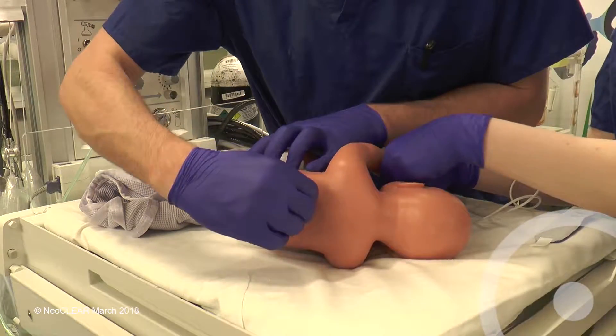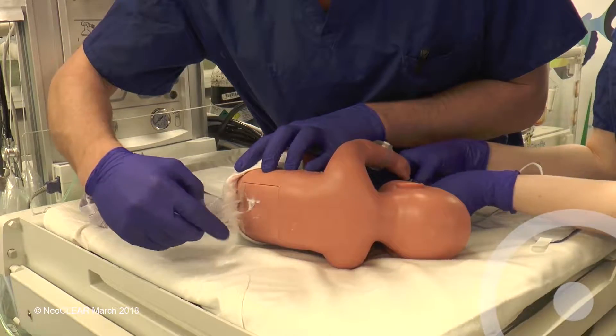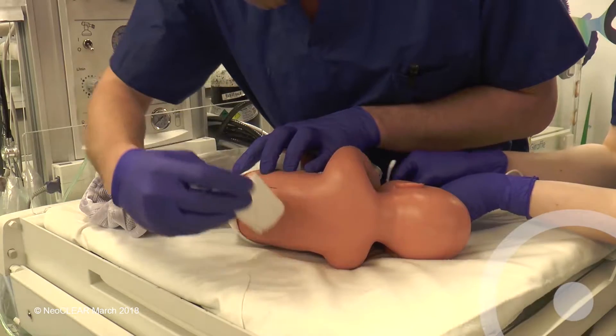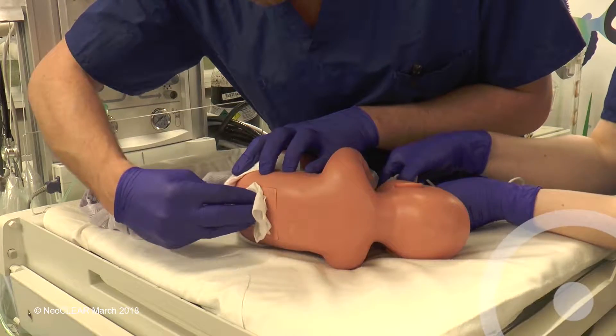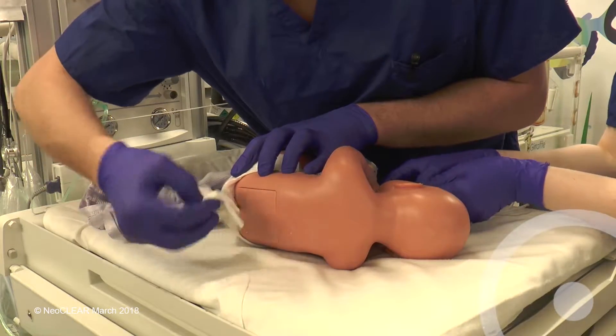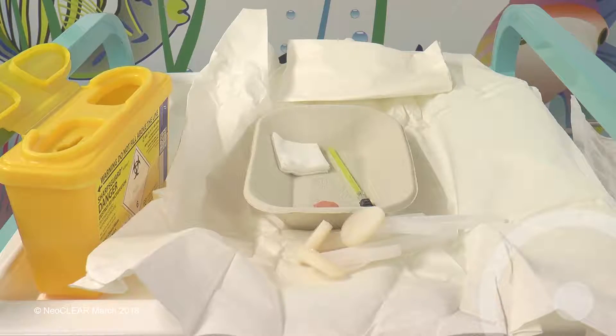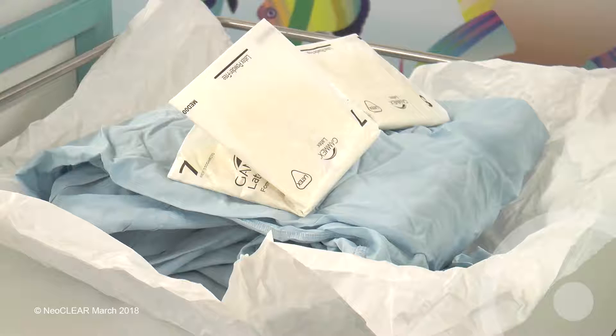Attach the SATS monitor to the right hand and ensure that the trace is adequate. Prepare the equipment including a 22 gauge Quink LP needle, sterile pack, chlorhexidine and alcohol based cleaning materials, two pairs of sterile gloves and a gown.